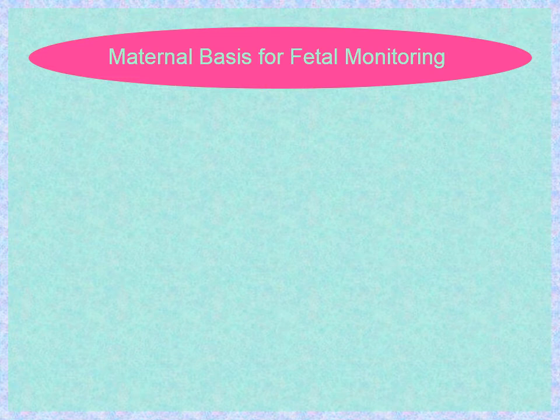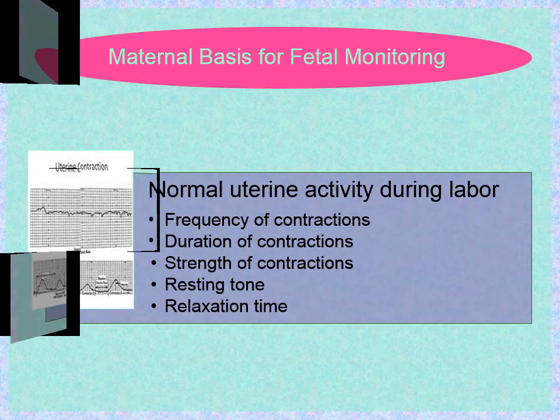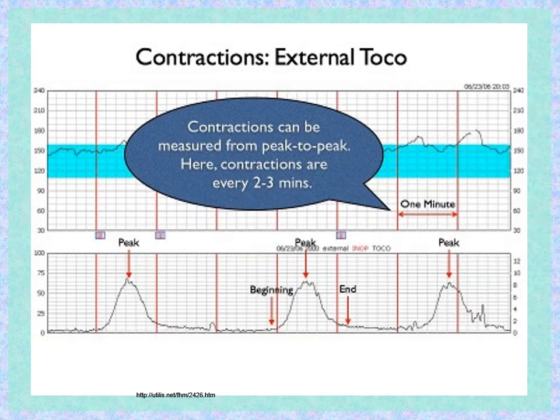The maternal basis for fetal monitoring includes normal uterine activity during labor, monitoring the frequency of contractions, the duration of contractions, the strength of contractions, the resting tone, and the relaxation time. Let's discuss contractions.